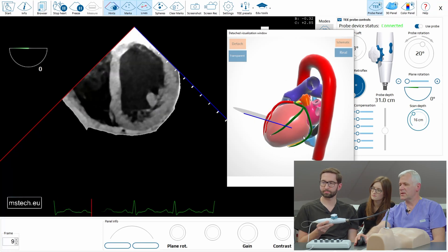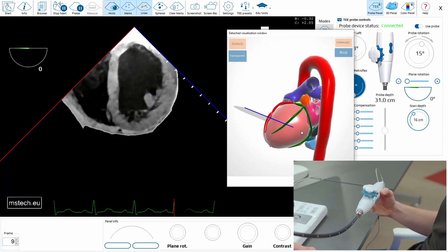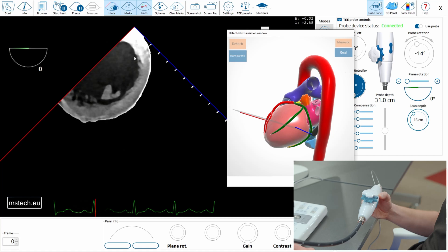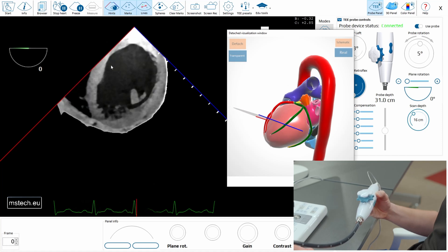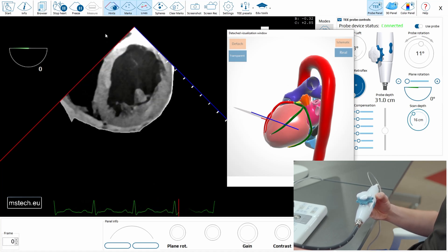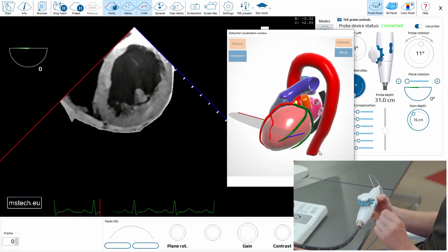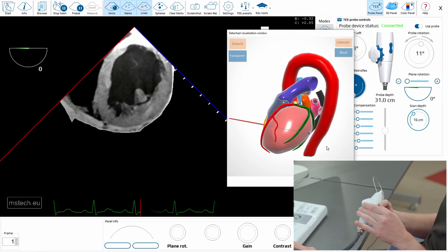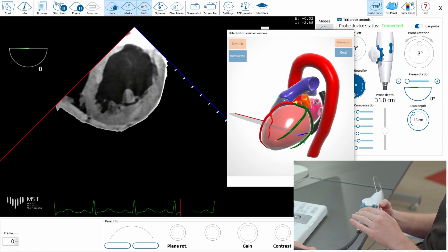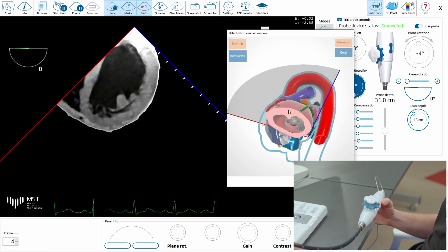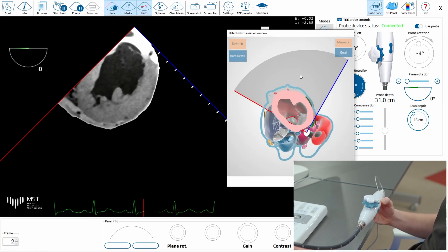Do you think it's really a short axis view? No, because it's not round — it is elliptic. So what do we need to do to make it round? You see, it's not round.